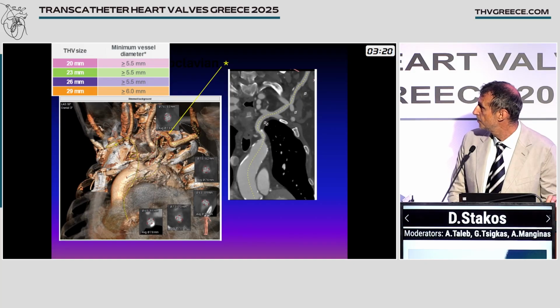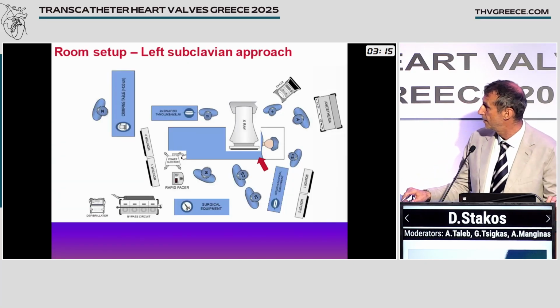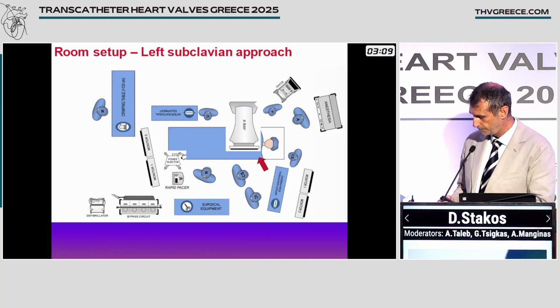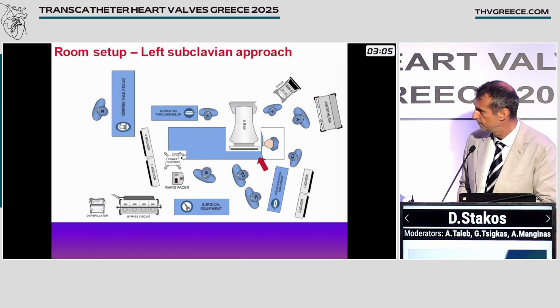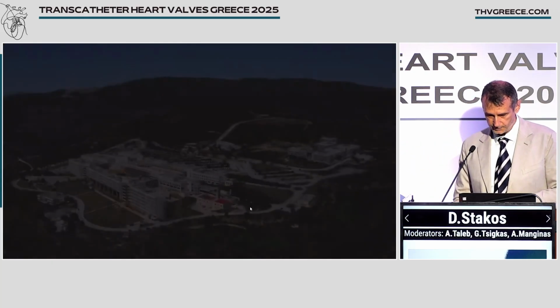These are the measurements of the subclavian artery. This is our setup. We proceed from the left. This is exactly our setup. Here are the operators, the vascular surgeon, and now we'll proceed.